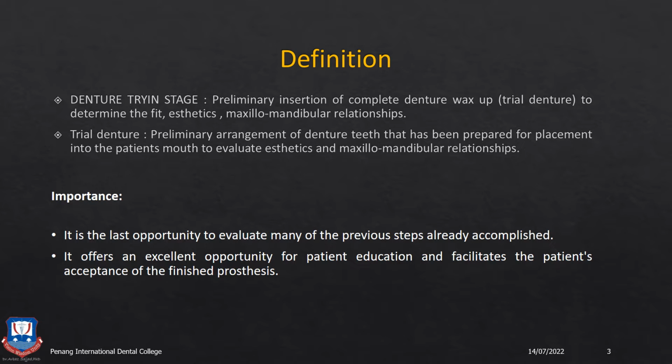So this is a good opportunity to let the patient know what to expect from the denture, what his expectations should be from the current trial setup that you have given him, what he needs to do to take care of this denture, and what needs to be done to be rehabilitated at the earliest with these dentures before the final process is finished. So it is more like a two-way communication between the dentist and the patient, and once both are satisfied, the denture can be finalized and the acrylization and finishing of the denture can begin.